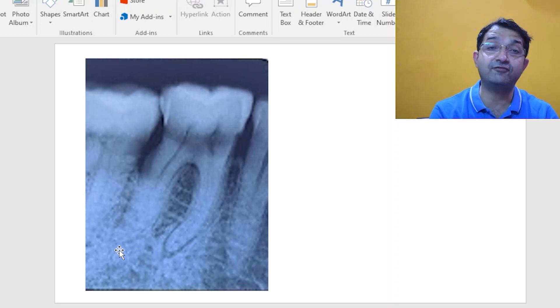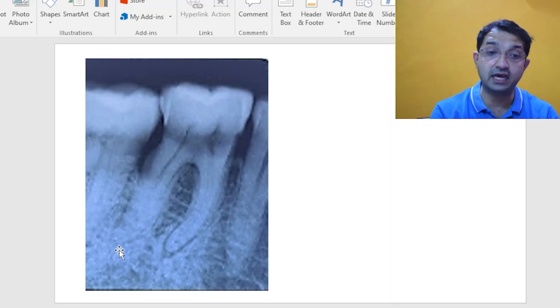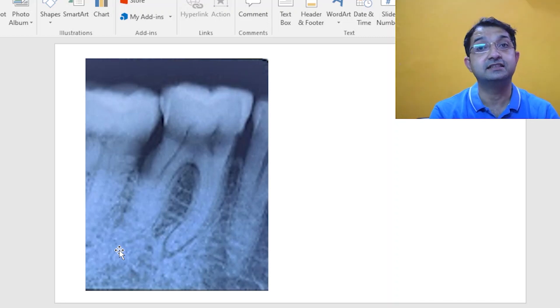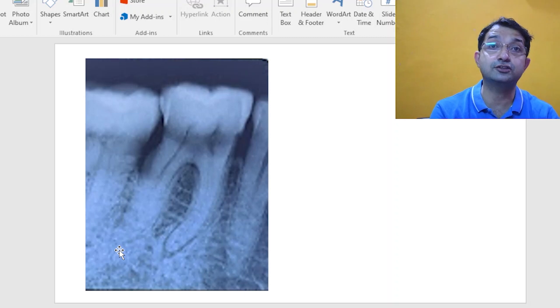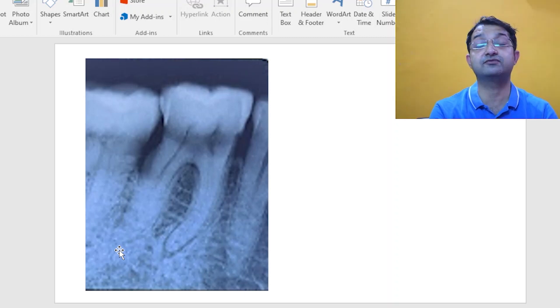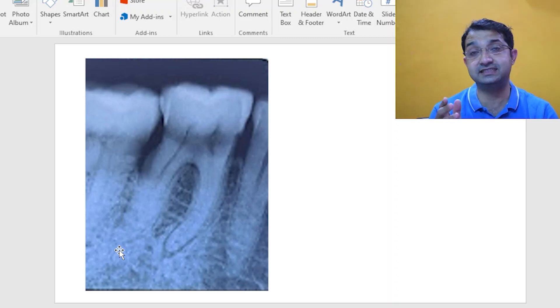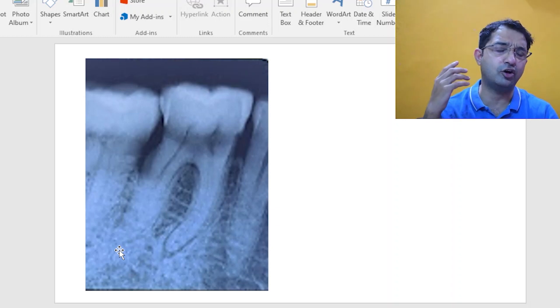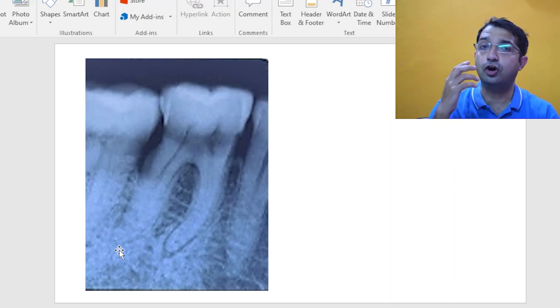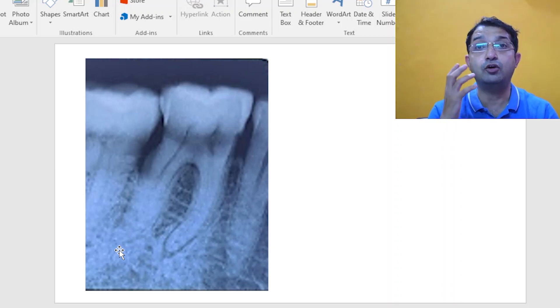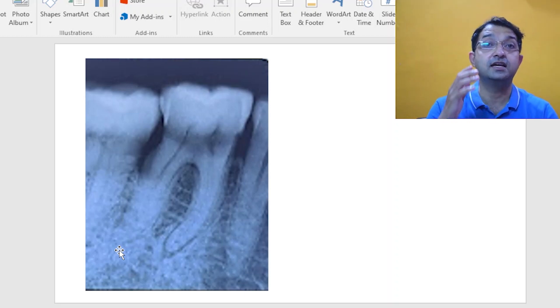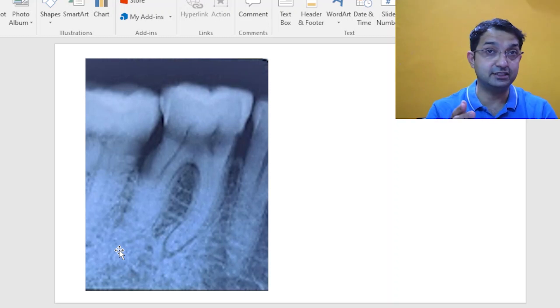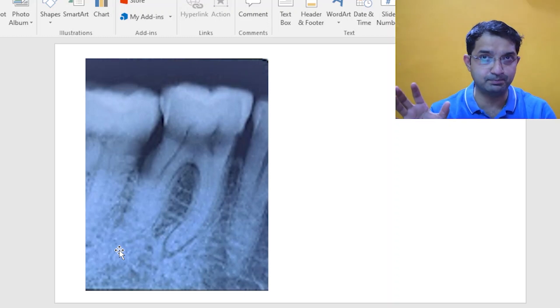Now similar type of a finding which is also seen in molar area has similar type of radiographic appearance and that is called a cementoblastoma, and this is very often asked in various entrance exams including Indian or Middle East or the NBDE. Now how do you differentiate the cementoblastoma from the condensing osteitis? The answer is really simple.